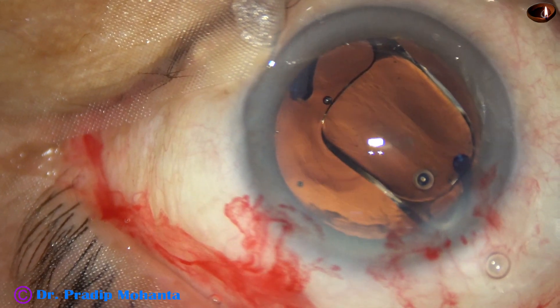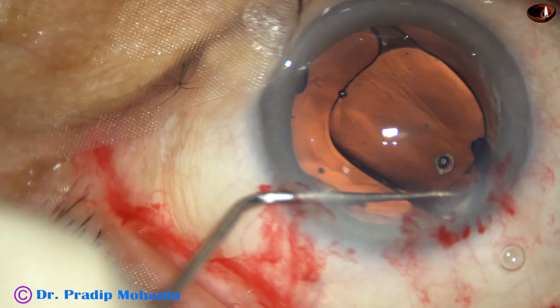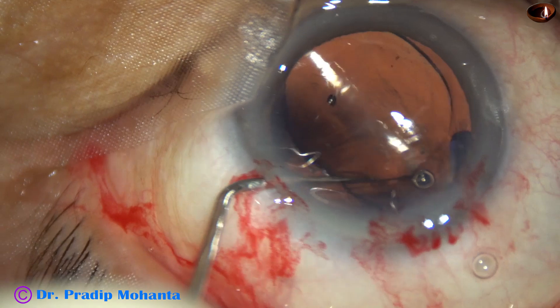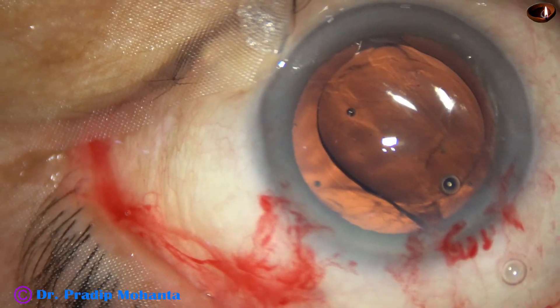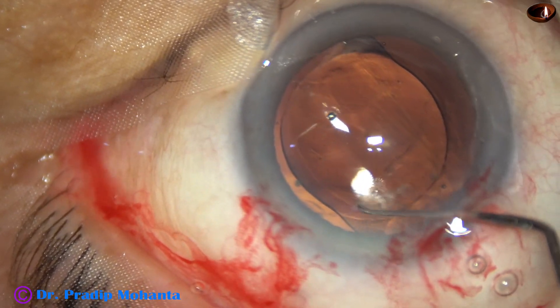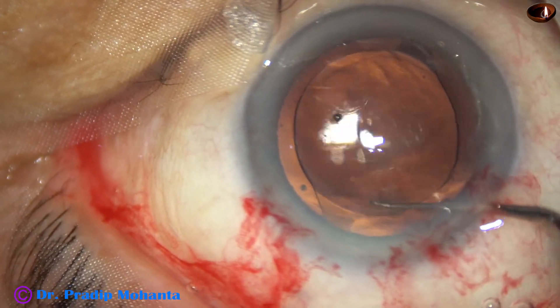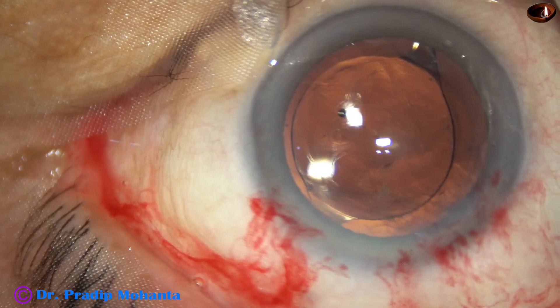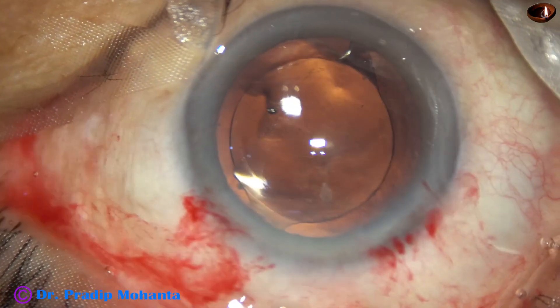Now I use a Simco through the side port and place the trailing haptic in the capsular bag. The lens is nicely placed in the capsular bag.